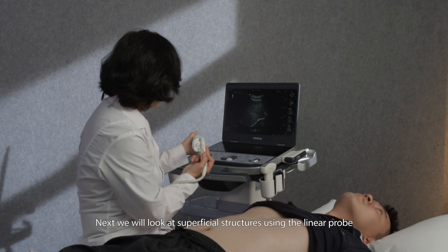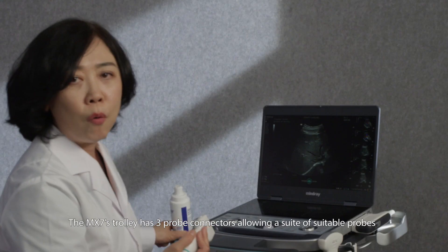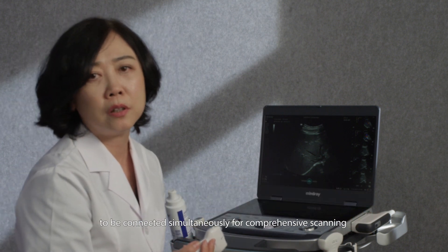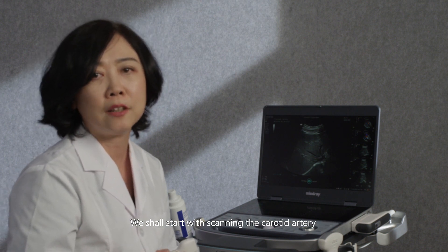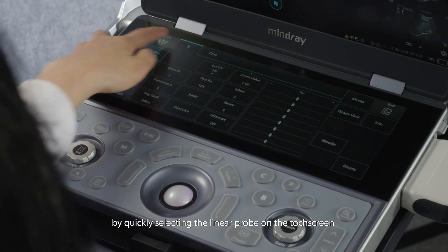Next, we will look at superficial structures using the linear probe. The MX-7's trolley has three probe connectors, allowing a suite of suitable probes to be connected simultaneously for comprehensive scanning. We shall start with scanning the carotid artery by quickly selecting the linear probe on the touchscreen.